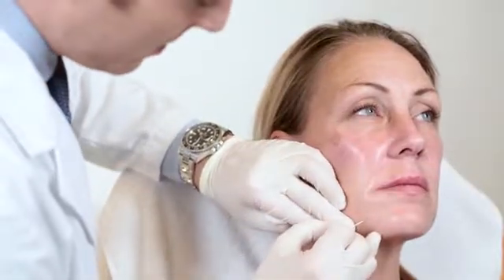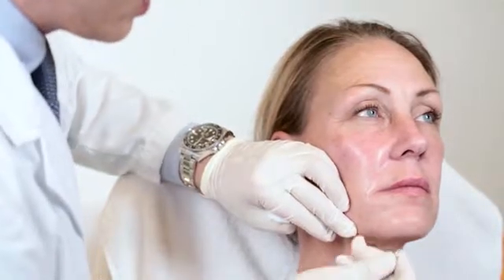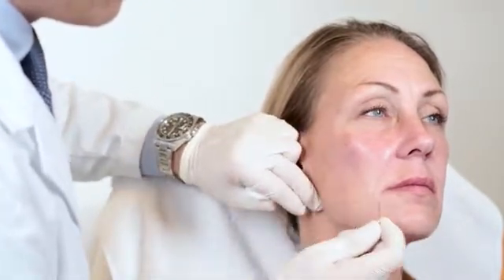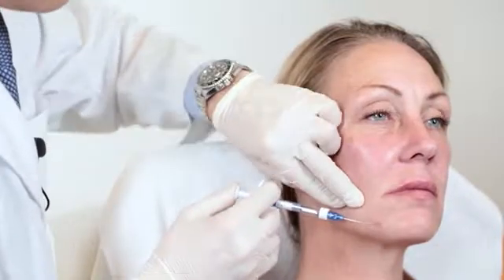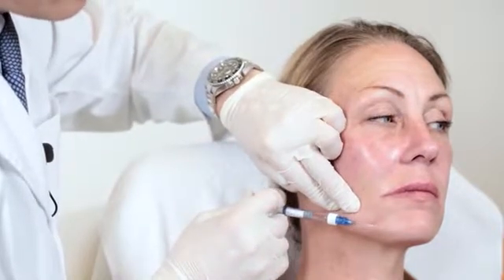The next step is to hide the beginning jowl by injecting the pre-jowl sulcus. When doing so, you have to be careful not to widen the chin too much, not to masculinize the look of your patient. I pierce through the skin, and then I go on with the microcannula fanning Restylane into the pre-jowl sulcus, giving it a smooth transition from the posterior aspect of the mandible. When injecting this area superficially, there is no need to use a cannula. It's just more convenient for the patient, and also I find this area bruises easily.